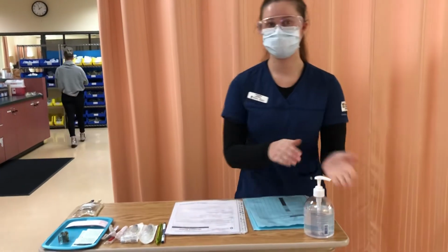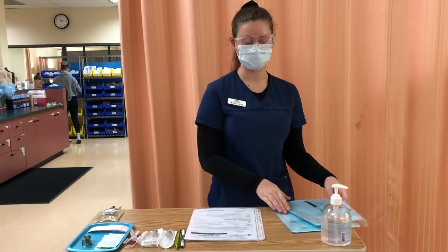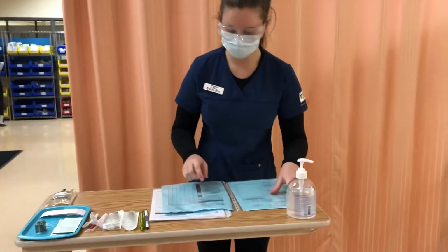Heather Milan, and I'm going to be administering morphine PCA to my patient today. So I'm going to wash my hands, and the first thing I'm going to do is make sure that the physician's order and the MAR are exactly the same. So here I have the physician's order and the MAR.